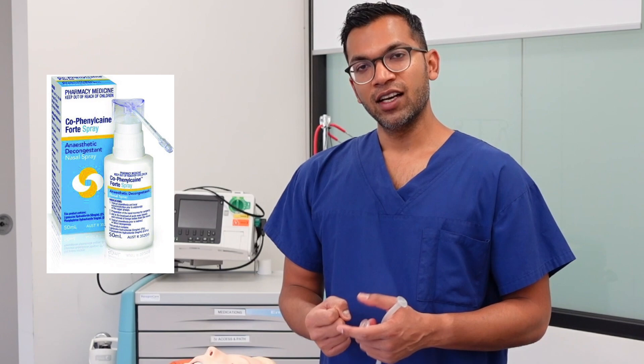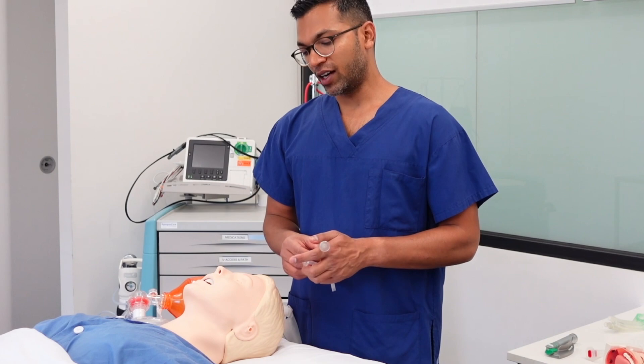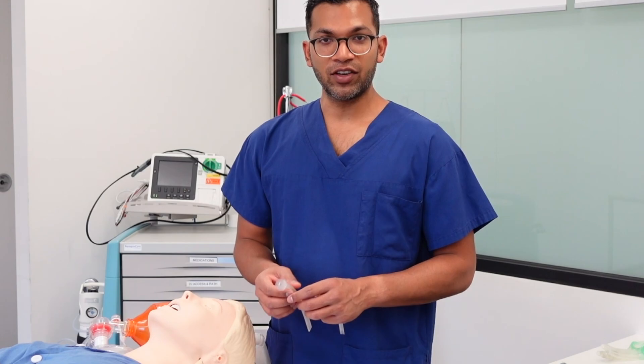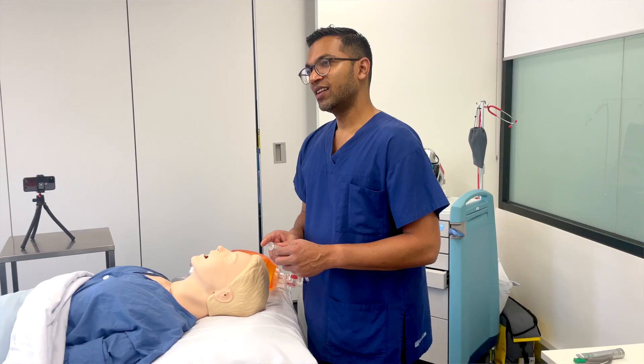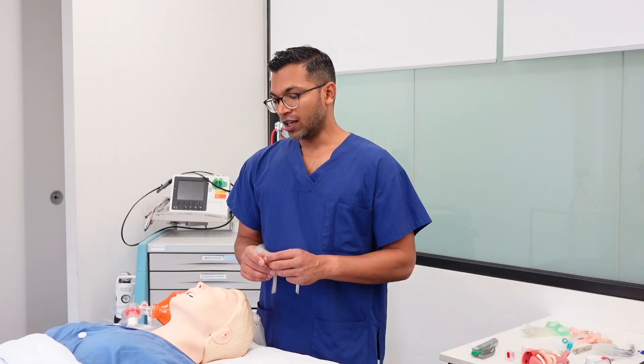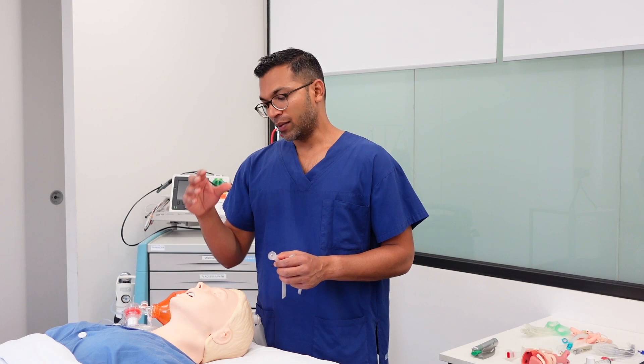Important contraindications for the nasopharyngeal airway: be very careful in patients on anticoagulants such as warfarin, rivaroxaban, or antiplatelet agents due to the risk of epistaxis. A significant contraindication is trauma or base of skull fracture — inserting a nasopharyngeal airway in this context could cause it to pass through the base of the skull into the brain. Avoid it in any trauma patient or anyone who has had surgery in that region.